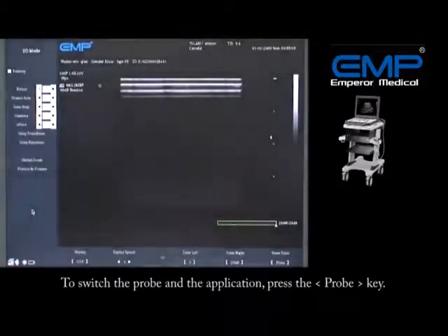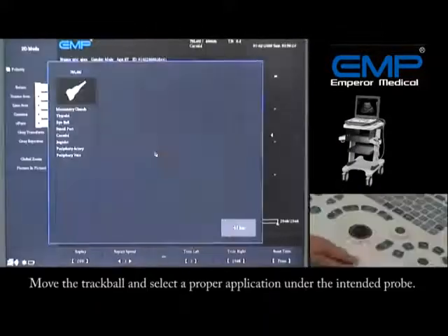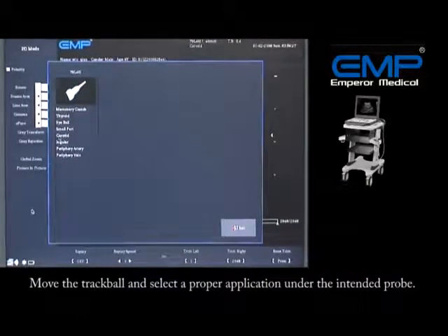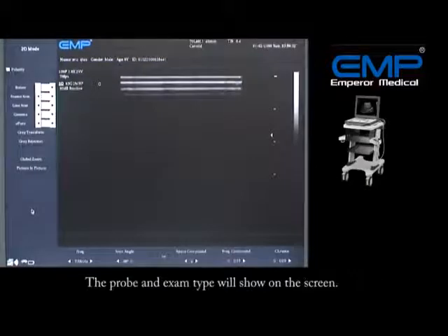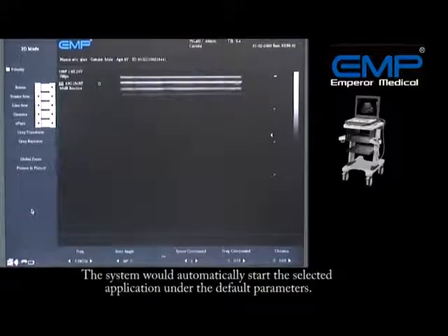To switch the probe and the application, press the Probe key. Move the trackball and select a proper application under the intended probe. The probe and exam type will show on the screen, and the system will automatically start the selected application under the default parameters.